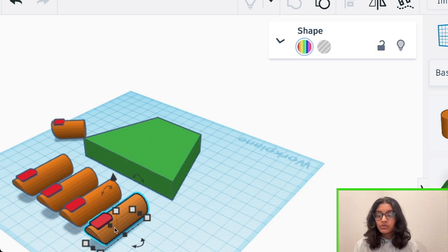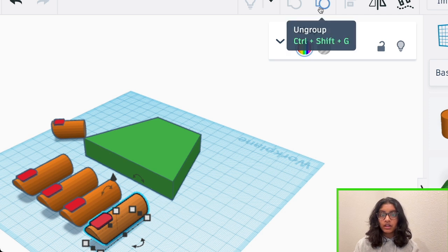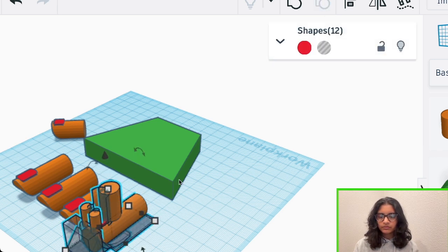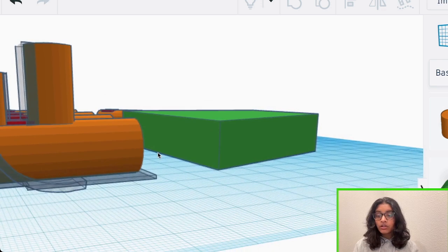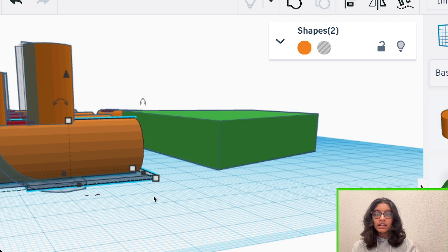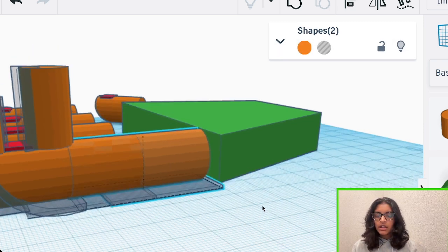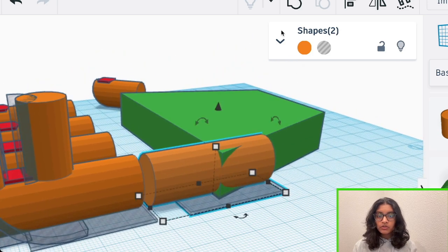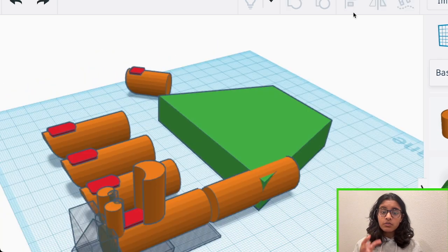So to do this, you're going to click on one of your fingers and click ungroup. And click ungroup as many times as you can until everything is ungrouped. Once that's done, you're going to want to shift and click on the only two objects you need to make the middle joint, which is this cylindrical object and the rectangular hole underneath it. You're going to click Command C and Command V or whatever your copy and paste controls are, and this is going to serve as the middle joint of your finger. Just group your middle joint together. Sometimes regrouping a finger like this can be super annoying, so I would just duplicate one of your other fingers.